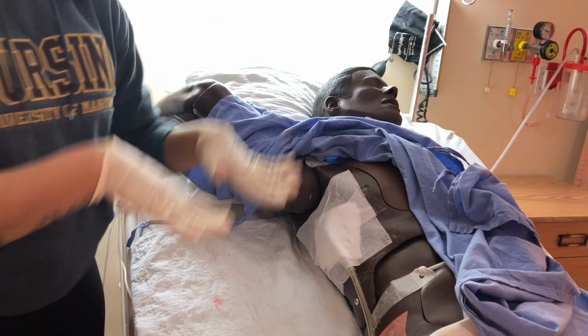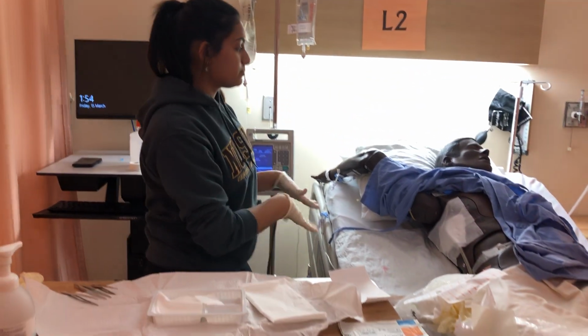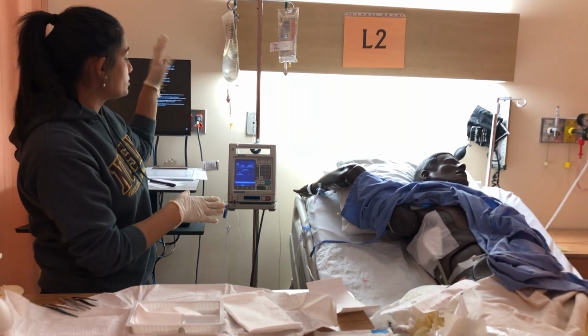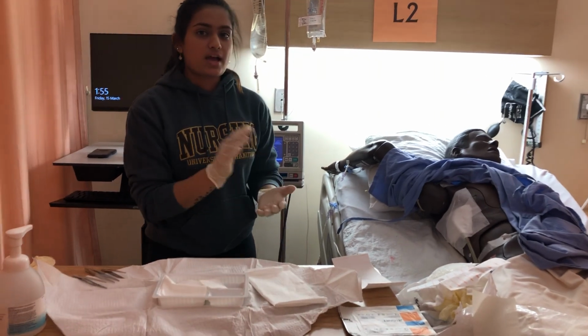Right, now that I'm done, I'd put the patient in a comfortable position. I'd clean all my supplies up, do my exit safety check, which would include putting the bed at the lowest position. Call bell would be in reach, and that is it.